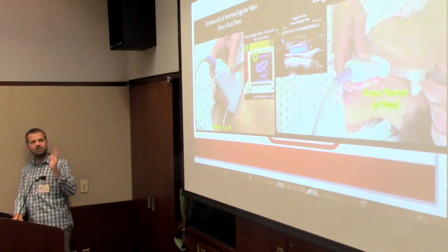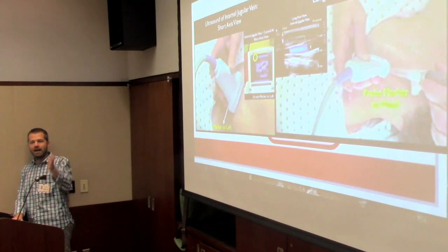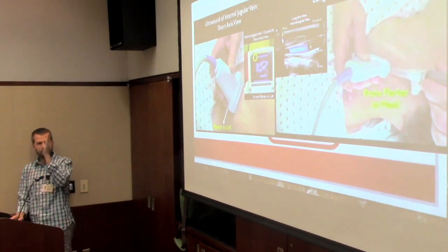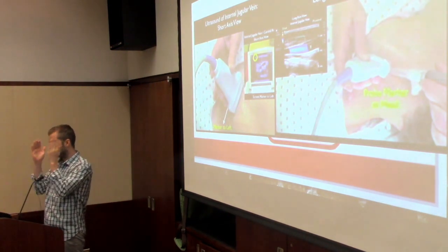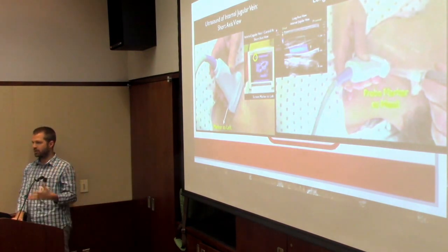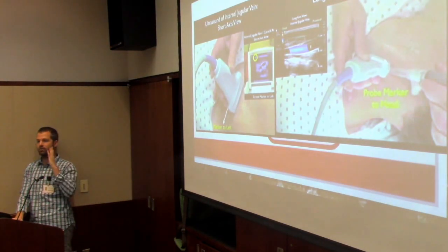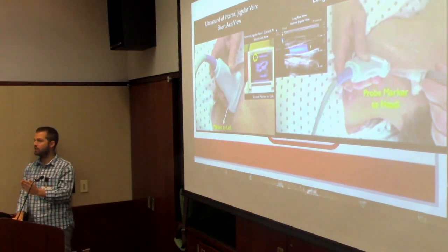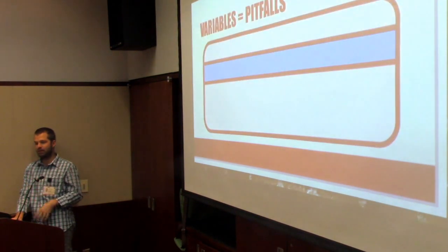So sometimes with patients, I'll take the probe, get a long axis, and remind myself that that's the direction, and I'll either draw a line alongside it, or I'll position them so that that's straight to me. So that by default, I know that I'm putting my needle in this direction. That applies to ultrasound guided IVs, central lines, everything. You may even want to position the patient so that that straight line gets even straighter or is in a better position for you. So even before you stick the needle in, it's good to know where you're going so you can set the patient up.